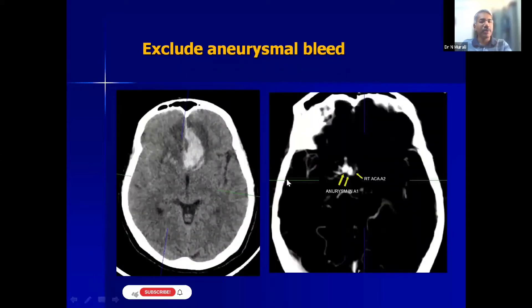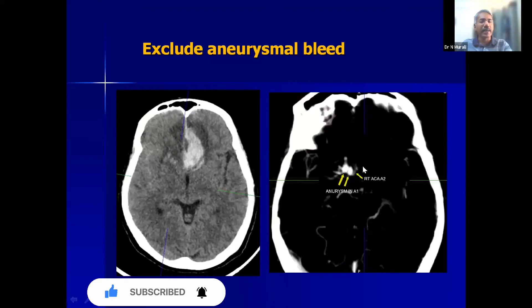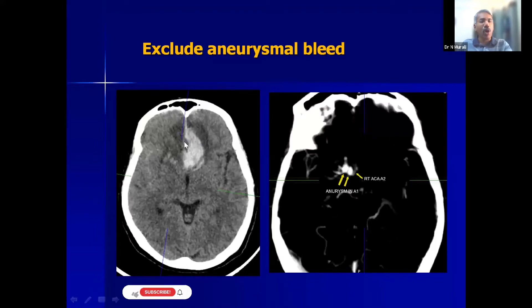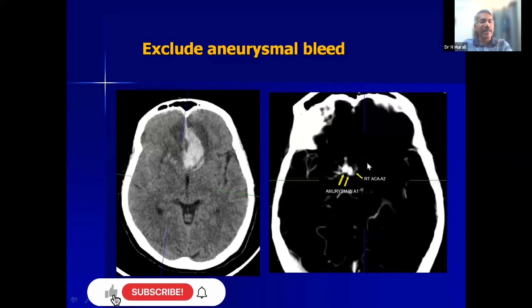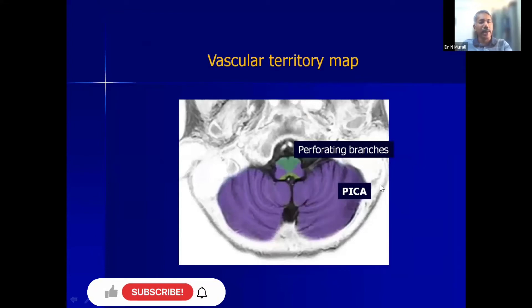Another type is aneurysmal bleed, which requires completely different intervention. When there are saccular outpouchings of the arteries supplying the brain — in this case an A1 segment aneurysm of the anterior cerebral artery — on post-contrast CT angiography you can see the bilobed aneurysmal sac. Because it has ruptured, there is a classical dissection of the hematoma into the brain parenchyma surrounded by edema. This patient needs interventional radiology but not stroke management.